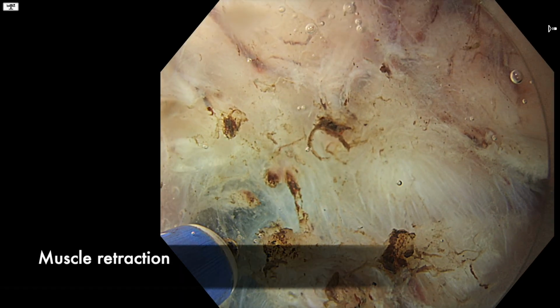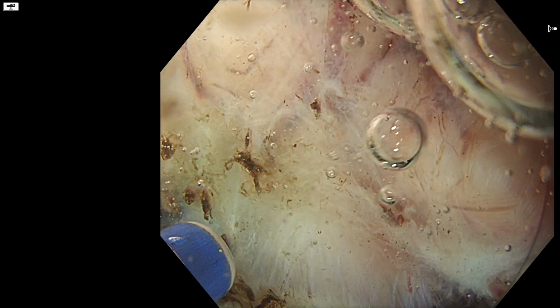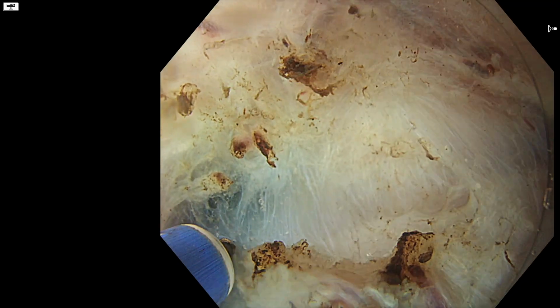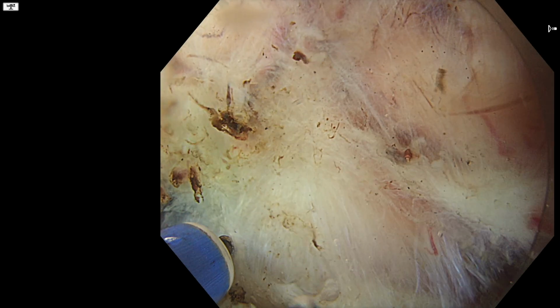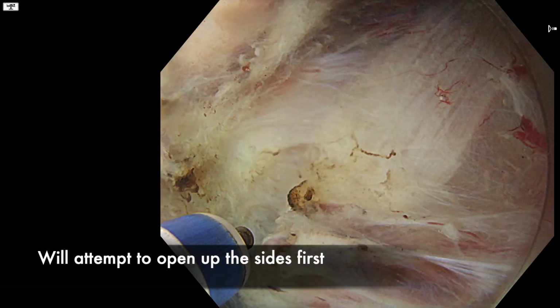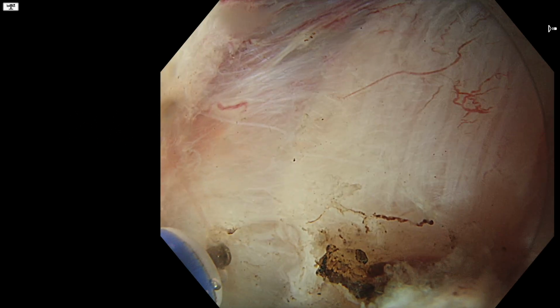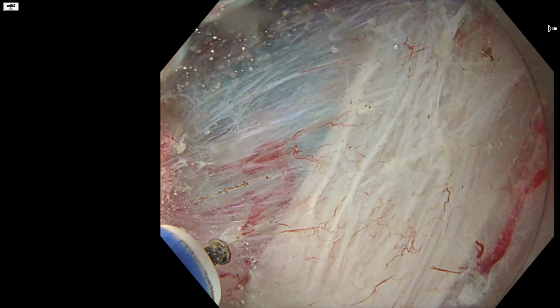Okay, so I've fast forwarded and we're now roughly 8 centimeters into the pocket, but we've now reached an area of clear loss of plane, so there's visible muscle retraction here. The strategy is usually to try and open up the sides a little bit and then draw an imaginary line between both sides of open submucosa, and sometimes you can see the contour of the muscle, as is the case here, so I try and follow that ever so slowly.